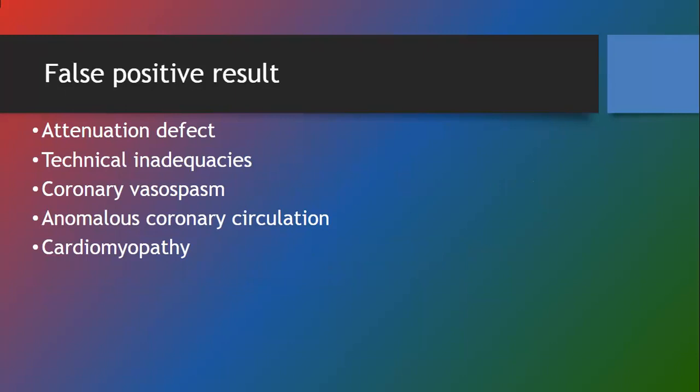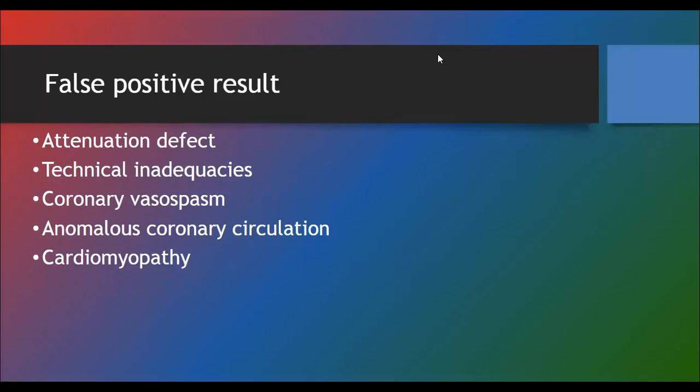If there is a defect on the myocardial perfusion scan, but you are calling it a false defect due to attenuation, that you are saying there is a defect in the inferior segment but that inferior segment defect is a false defect, how will you answer this?